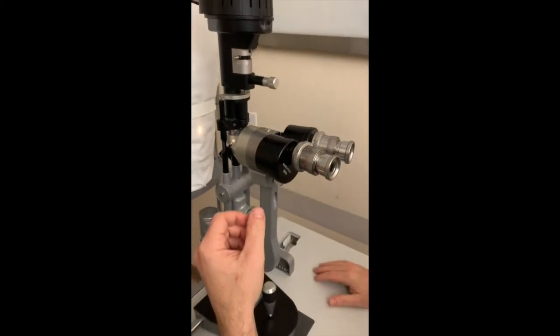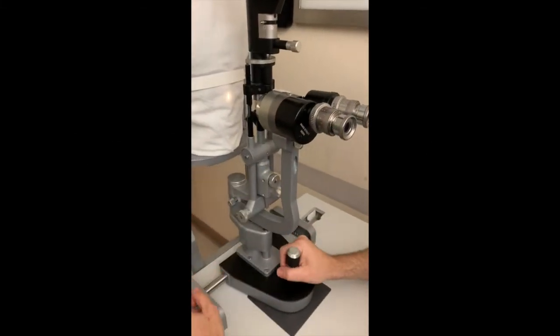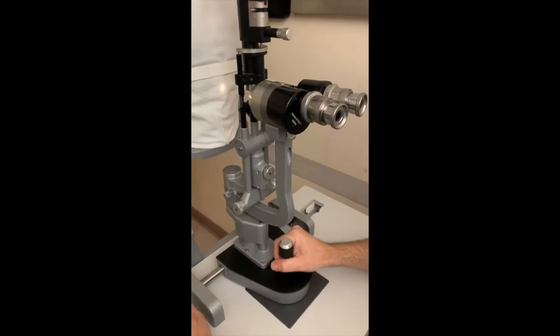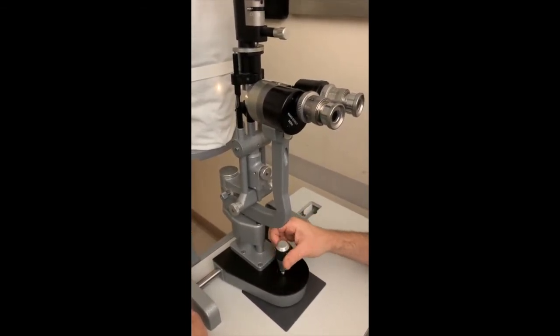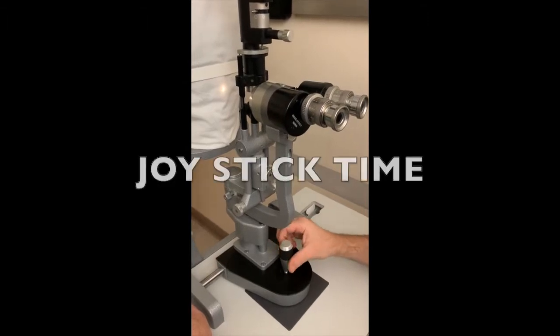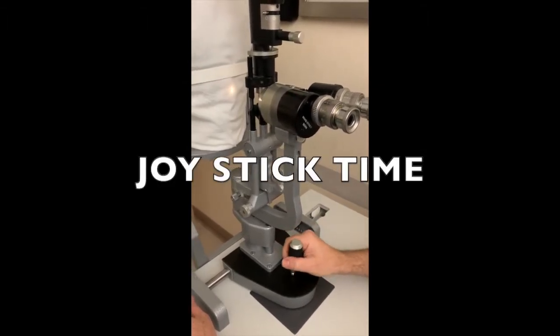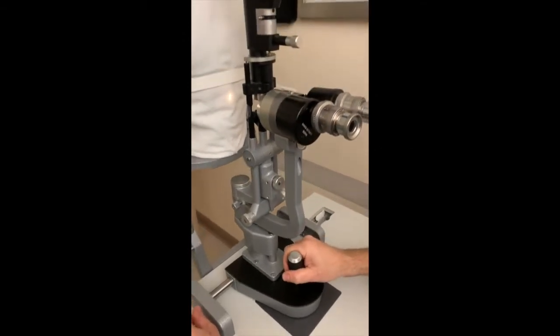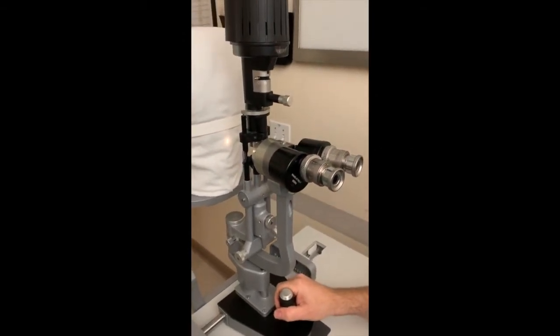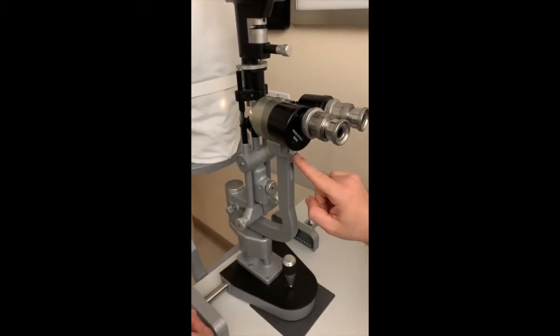So then the only thing left is operating the table. Actually, there's two things left. Operating the table: you turn the dial to go up and down. And then you use the joystick, obviously, to move the light around. All right. And then the last thing is the magnification.